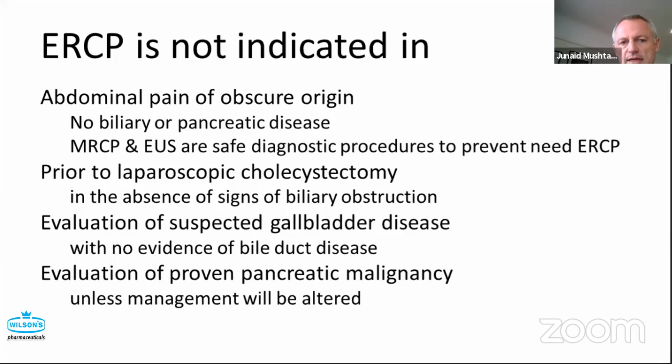ERCP isn't indicated either for evaluation of suspected gallbladder disease if there's no evidence of any problems in the bile ducts themselves. And again, for pancreas cancer, it's really not indicated unless the management will truly be altered.